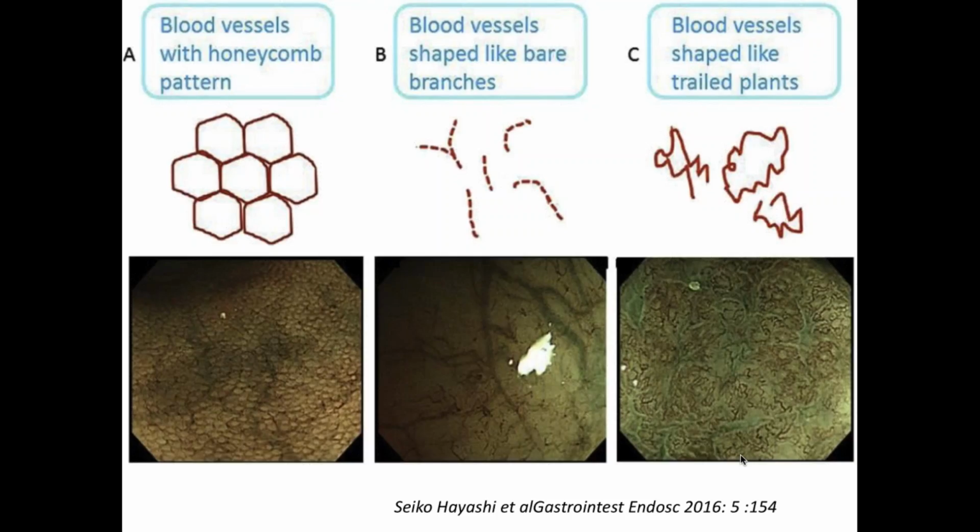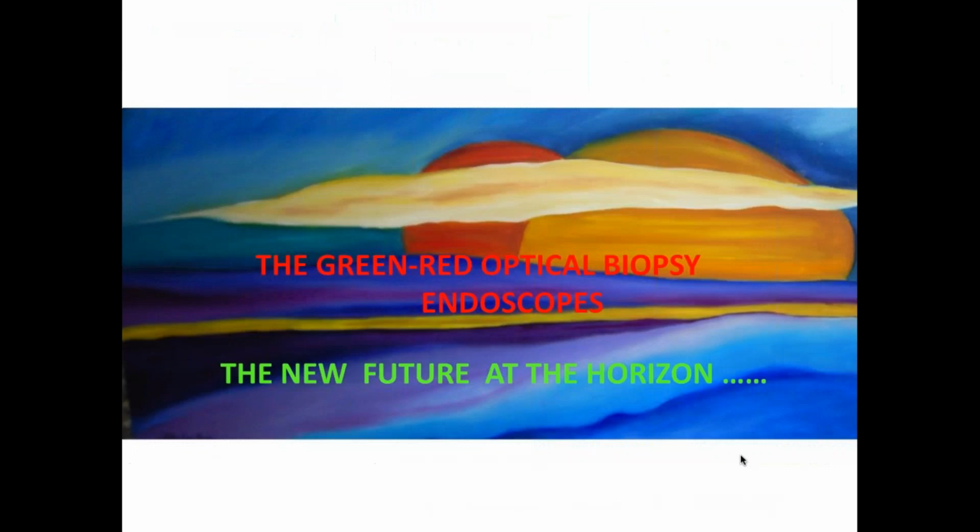So this is really important because the great assessment of your vascular pattern prevents and predicts outcome, flare-up, and complication, and helps endoscopists in IBDology to optimize the treatment. But the future at the horizon is the new generation of the scopes. Some are already in use, some are upcoming.